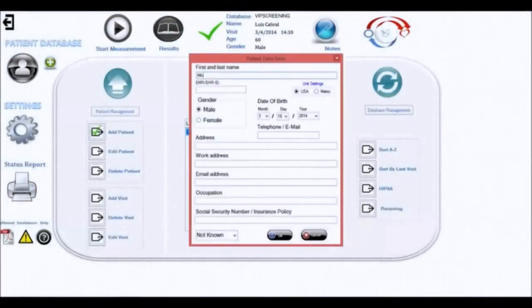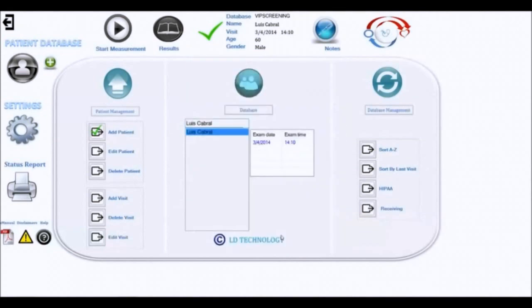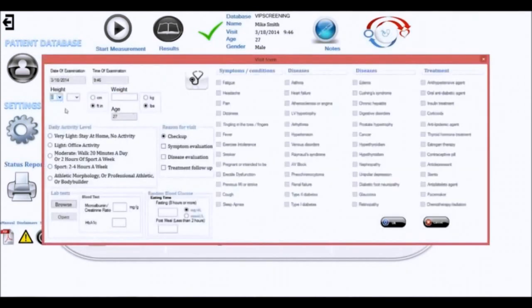To register a patient, you will need to enter the patient's first and last name, gender, and date of birth. On the next page, you will need to enter the patient's weight, height, and activity level. Clinical information of the patient can also be entered, such as symptoms, diseases, and treatment.